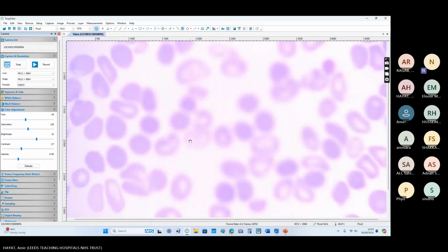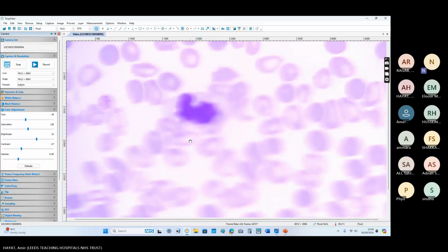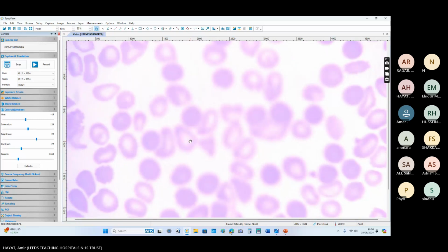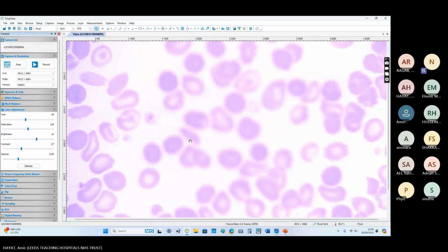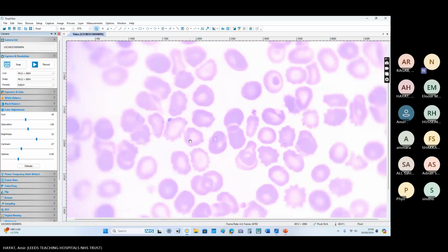So how would we report this case in the exam if we are not given the HPLC and there are only microcytic hypochromic cells, and the history is suggestive of some hemoglobinopathy, but we are not sure what it is exactly, though it seems to be more of an iron deficient picture?